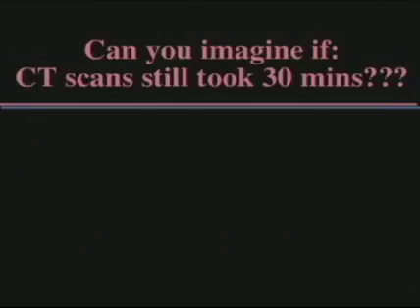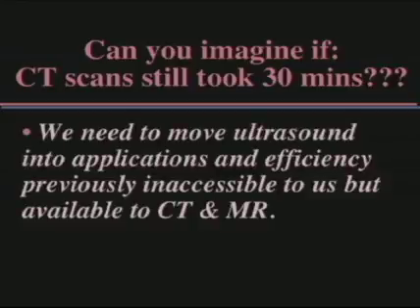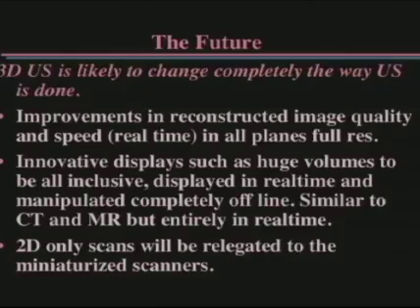So can you imagine if CT scans still took 30 minutes? We need to move ultrasound into the better efficiency, which was previously inaccessible to ultrasound, but is now available to CT and MR.